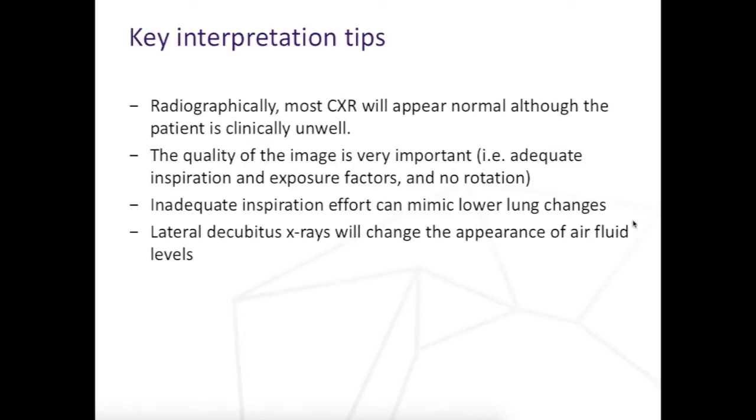So in terms of chest x-ray, some of the most important things that you should be aware of is that even though the patient is unwell, sometimes they actually might have a normal chest x-ray. For whatever reason, it could just be because whatever's causing them grief hasn't actually manifested in the chest yet. So don't be deceived and don't be surprised if the patient comes back in a day or two and suddenly their chest x-ray is no longer normal.